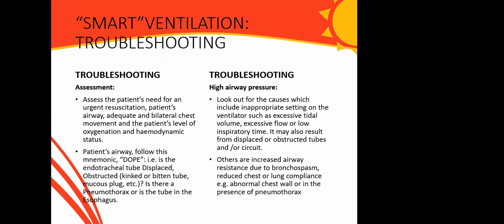If your monitor is showing you high airway pressure, you want to look out for the causes. Is there an inappropriate setting on the ventilator? Maybe you have given the patient excessive tidal volume, or there's excessive flow or low inspiratory time.